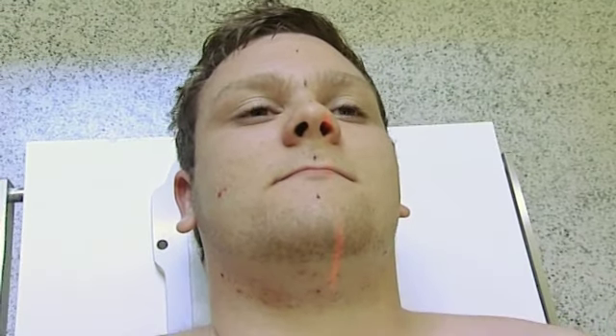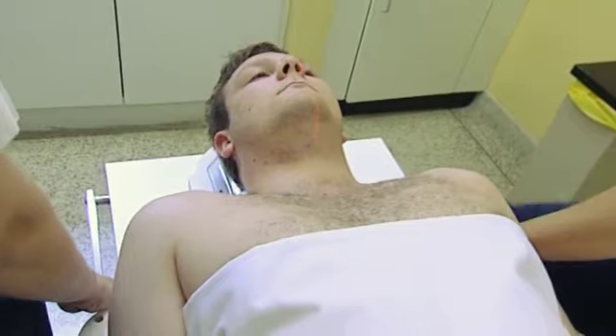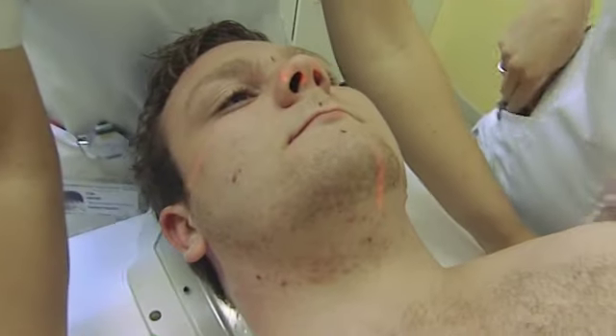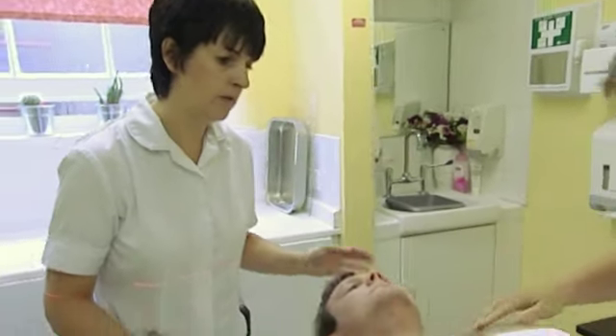I'll then bring the patient over to the treatment couch and position them as they would have been positioned in the simulator earlier in the morning. So nice and relaxed for me, nice and floppy. You're just going to find us moving you over slightly — just feeling for your bones.